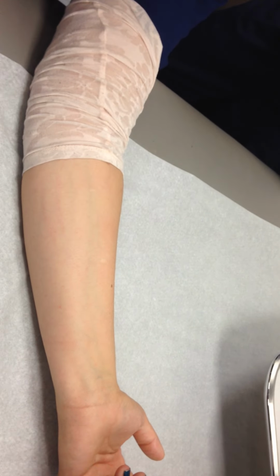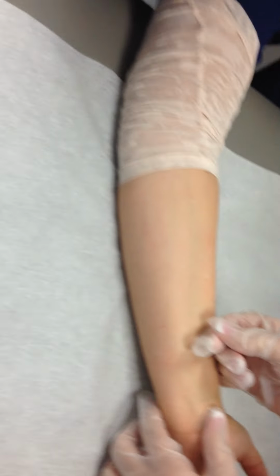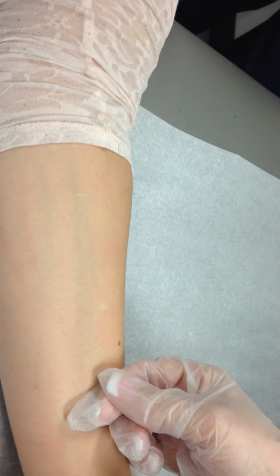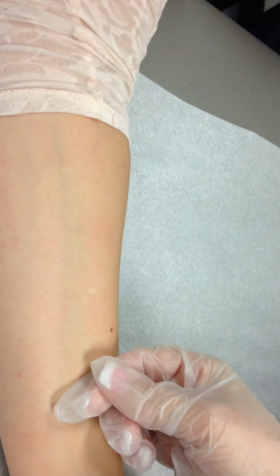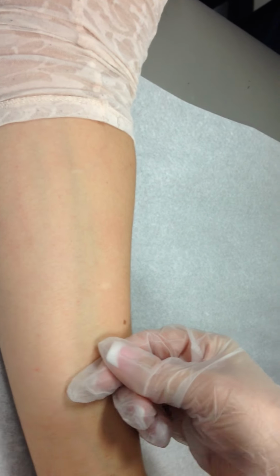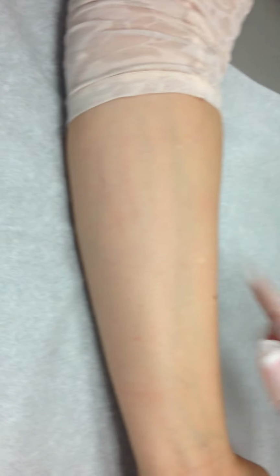If you don't see the wheel, you went too deep. Okay? Sometimes you'll be like this, and you'll go to put it in like this, and it starts squirting outside of here. It's because you're not far enough in. So you would go in just a little bit more, get that bevel up underneath of that skin, and then you're going to get your little wheel. And eventually it just kind of goes away.